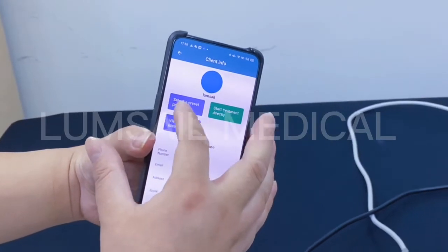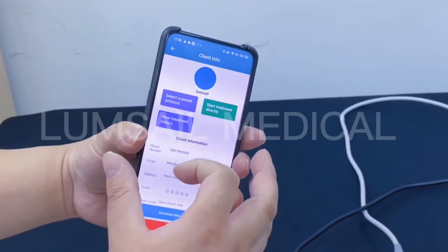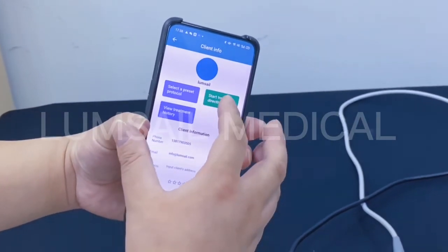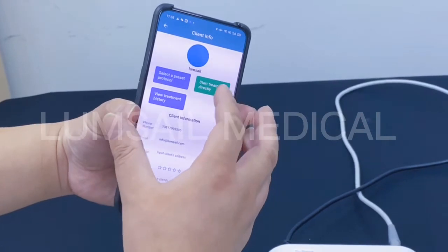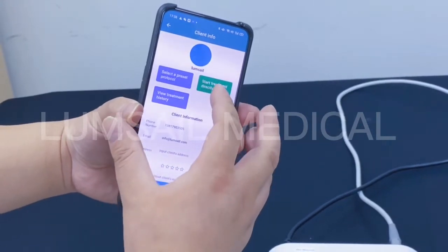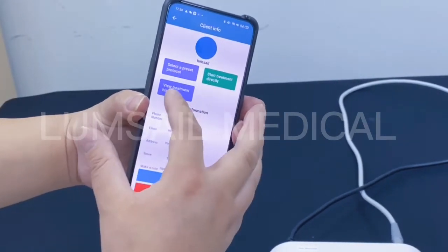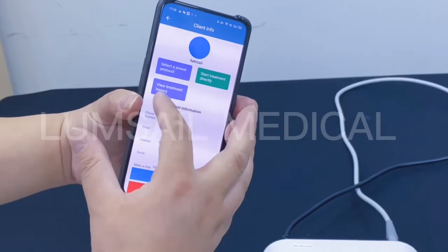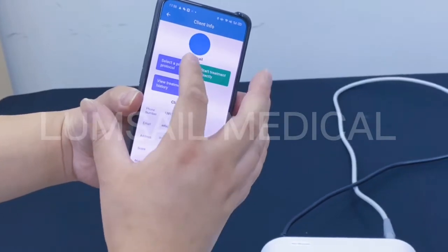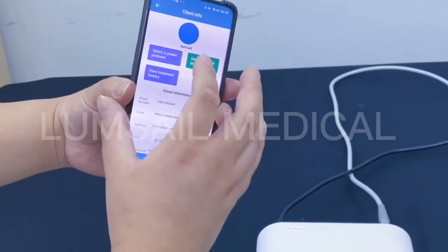There are several buttons: the first button is to select a preset protocol, the second button is to start the treatment directly without selecting a protocol, and the third button is to view the treatment history.